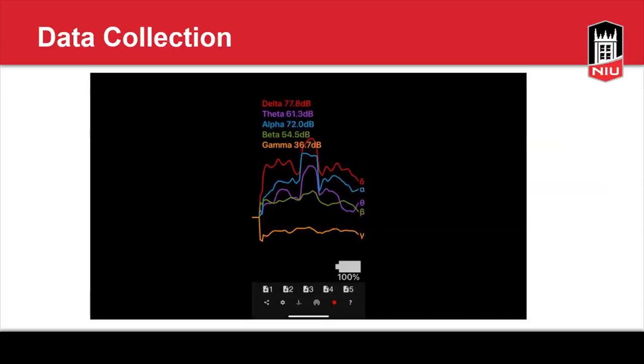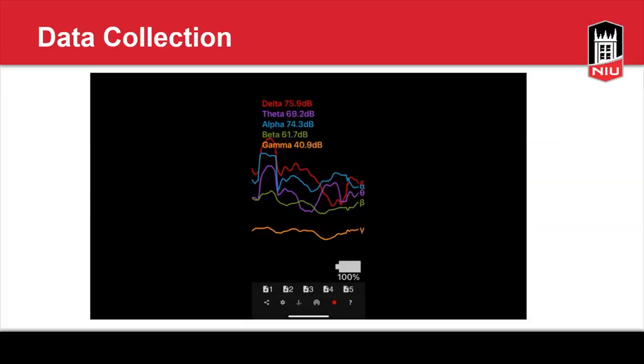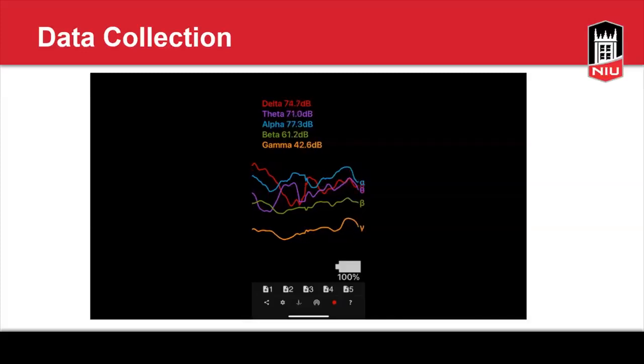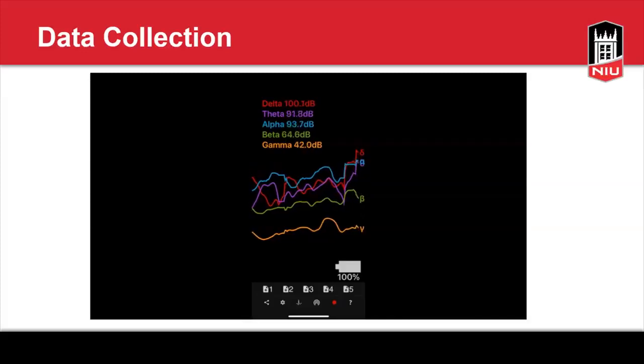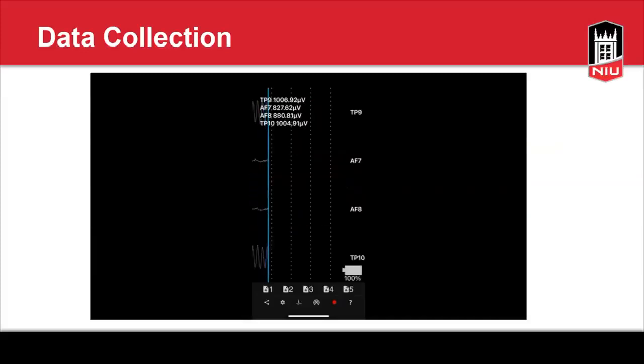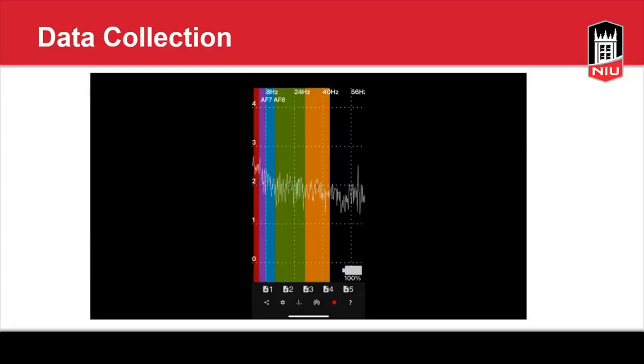It was me, and I was very relaxed, so mostly we could see slow frequency data from my brain right now. And there is a different data streaming button at the bottom. If we click this button, it's real-time streaming data with a different visualization. This is a micro voltage, a very low electrical signal. We can look at over 4 different channels.